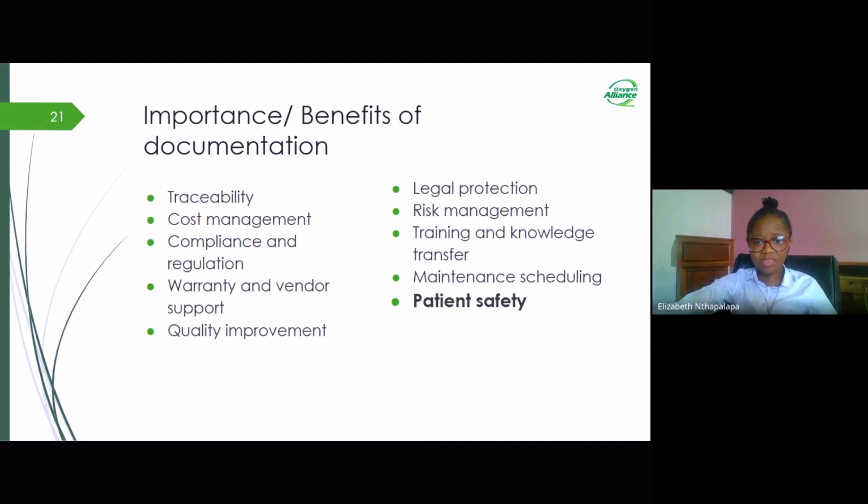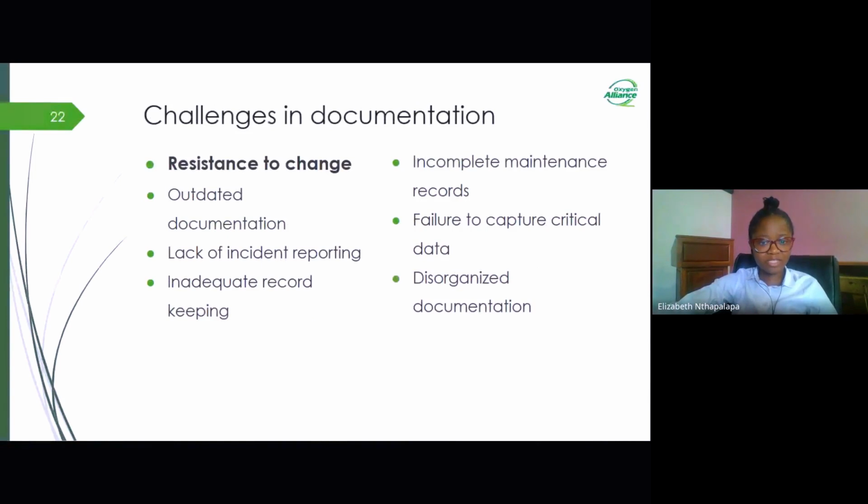After seeing the importance or benefits of documentation, now let's look at some of the challenges that we may face in the course of practicing documentation in the maintenance workshops and handling of medical equipment. Our first point is resistance to change. It can happen that staff may resist adopting new documentation systems or practices. Obviously, this hinders the implementation of something which is more efficient and effective. If we have this, it is a challenge for the facility to get all the information that it needs.